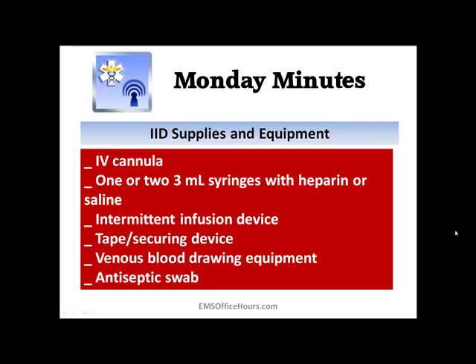Now you might also have some blood drawing equipment there as well, depending upon your system and whether or not they require you to draw blood. I've worked places that had different blood drawing equipment for different hospitals that we would transport to, because some hospitals wanted certain tops of blood tubes, other hospitals wanted other ones, some trauma centers wanted certain ones, and then others do not let you draw blood at all. So it depends upon where you work. So I'm adding this in here so that, if you are the type of person who likes to be prepared and have everything set up already, you might want to go ahead and include your blood drawing equipment in the IV start pack.